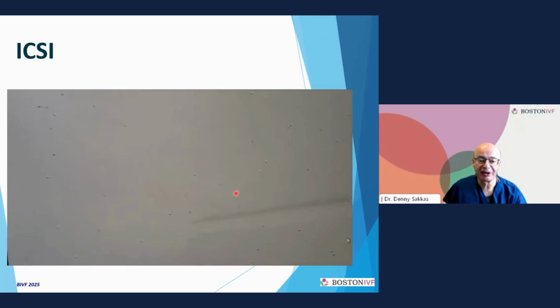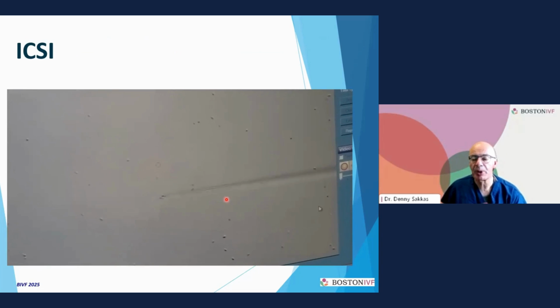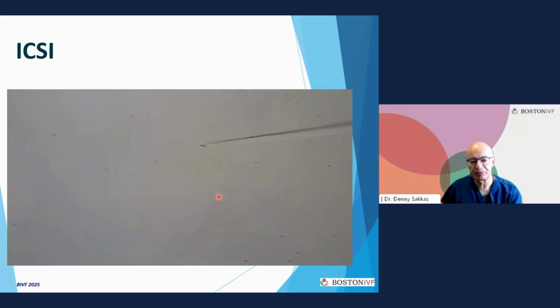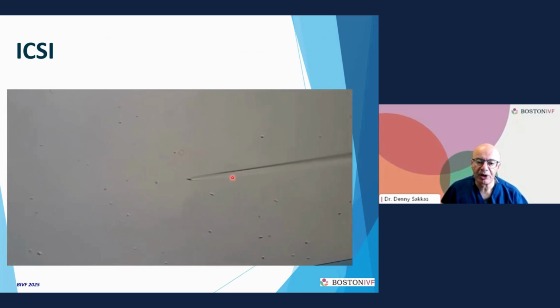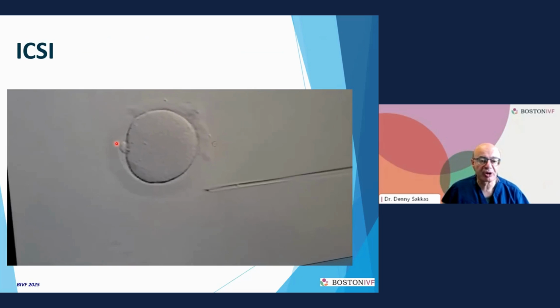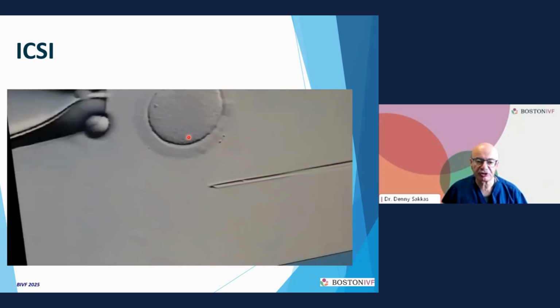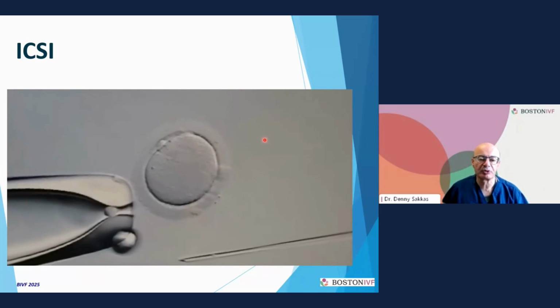This is an indication of how we do ICSI. You can see it's a very fine needle. This patient doesn't have many sperm, so conventional insemination, just putting in the sperm by itself and having them work it out, would probably not work. So we catch a sperm, and it goes into this very fine needle, so you can see the sperm coming in here. We then take that sperm and inject it into an oocyte. As I said before, this oocyte has this polar body, so it's ready to be fertilized. Those are the eggs we look for when we're doing ICSI.